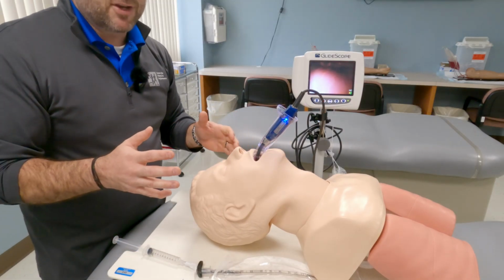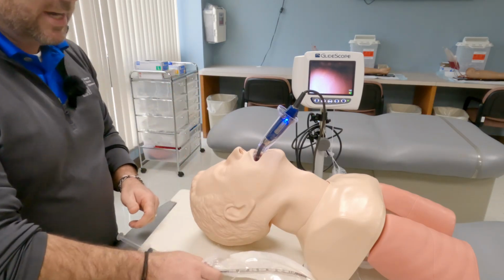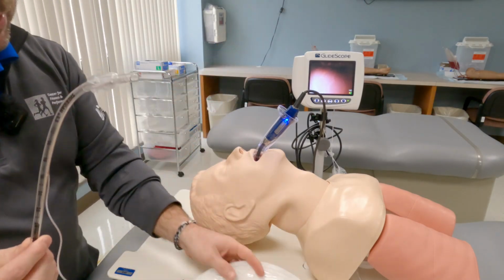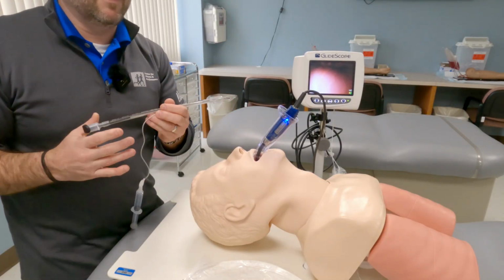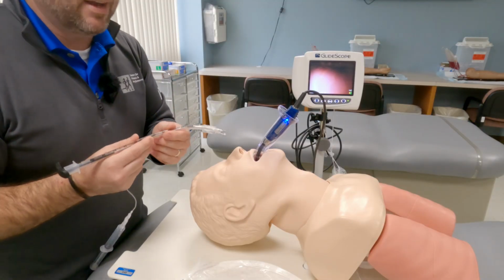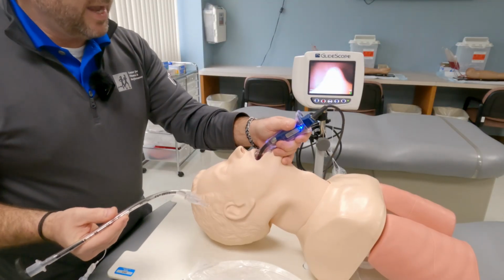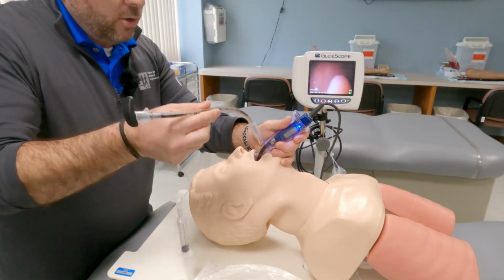This is one of the frustrating parts: sometimes you'll see beautiful cords and you'll have trouble getting the endotracheal tube in. Because of the rigid stylet, this is something you have to practice before you use it on a patient. It can go very quickly if you know what you're doing, but if not, you're going to struggle a lot.